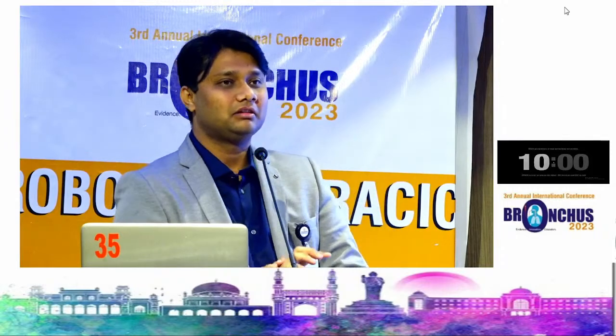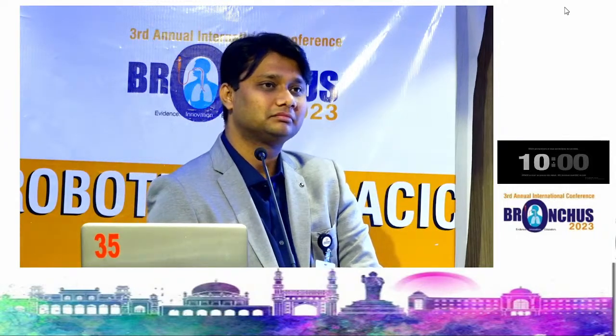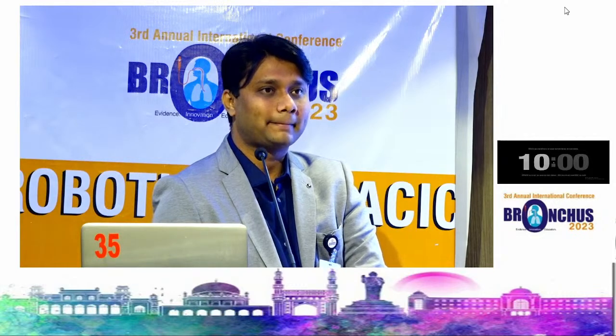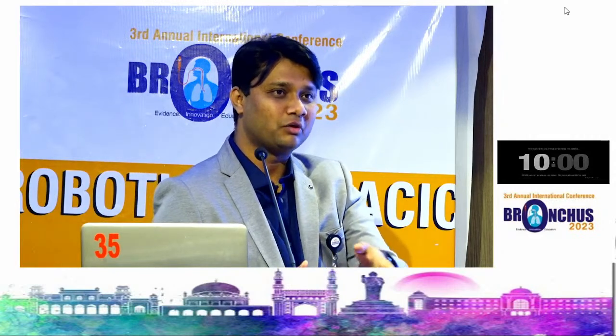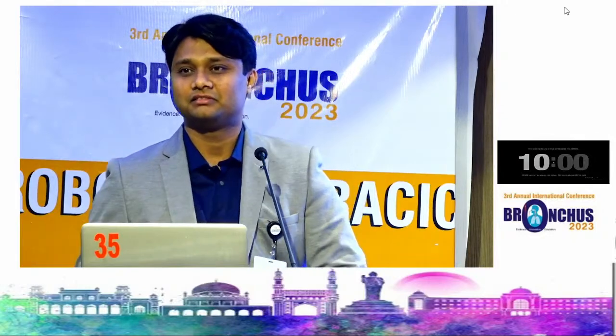So that's why I have devised that you can always put a camera in the 5th intercostal space, just go with VATS, and rather than taking down the whole thing, control the situation, and by VATS you can carry on without opening. The problem is that if you have bleeding at the hilum, then going through the 7th will be difficult.